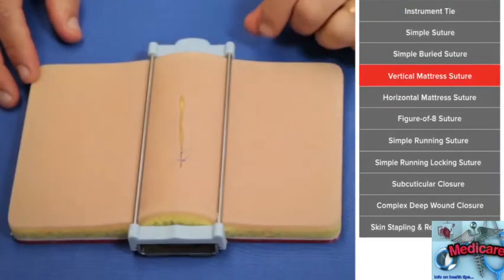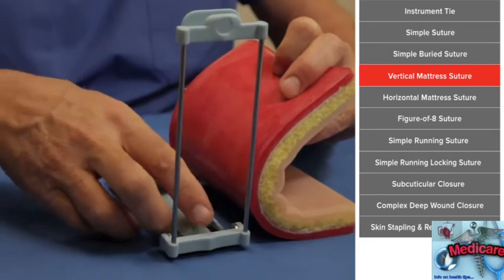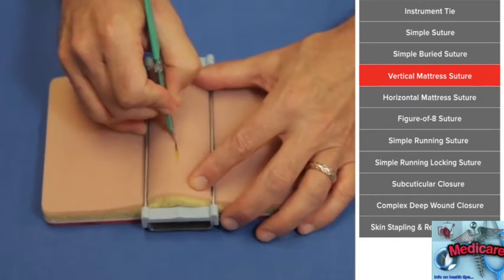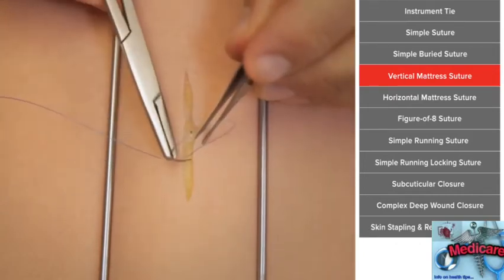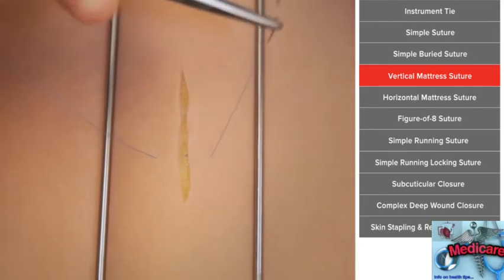Next, I'm going to show you a little more complex suture, the vertical mattress suture. Again, we're going to go ahead and open up the device that comes with your suture pad that helps to put tension on the skin. And when we go ahead and make a cut here, what happens is the skin gapes open. In order to take tension off this, sometimes a simple suture will just pull through, and we'll do a vertical mattress, which some people call the far, far, near, near.